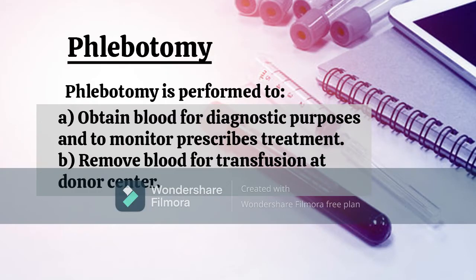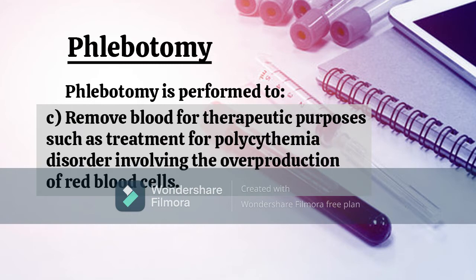Phlebotomy is performed to: A. Obtain blood for diagnostic purposes and to monitor prescribed treatment. B. Remove blood for transfusions at a donor center. C. Remove blood for therapeutic purposes, such as treatment for polycythemia, a disorder involving the overproduction of red blood cells.